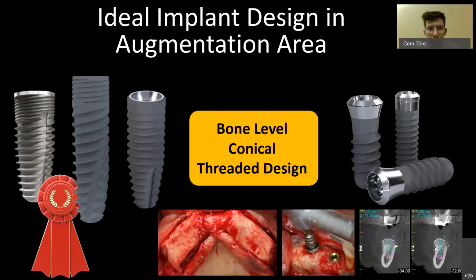What kind of implants should we use in the area that we have augmented? It's something that needs to be talked about as well. Well, for one thing, we want bone level implants. No tissue level implants with large machine surfaces, but rather bone level implants with minimal, if any, machine surfaces.